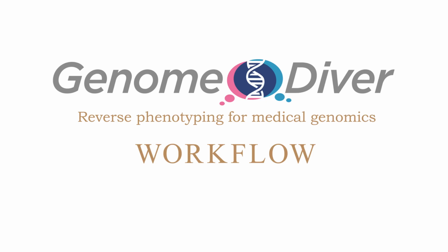The goal of GenomeDiver is to help improve our success in making diagnoses from genomic testing. The current problem is that clinicians have very limited means of communicating their insights to colleagues in genomic diagnostic laboratories. GenomeDiver is designed to facilitate this communication.